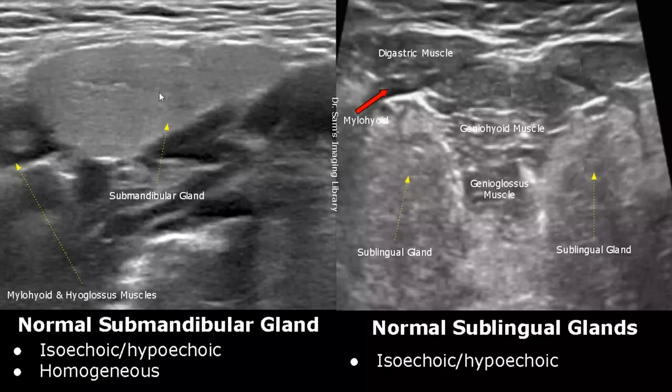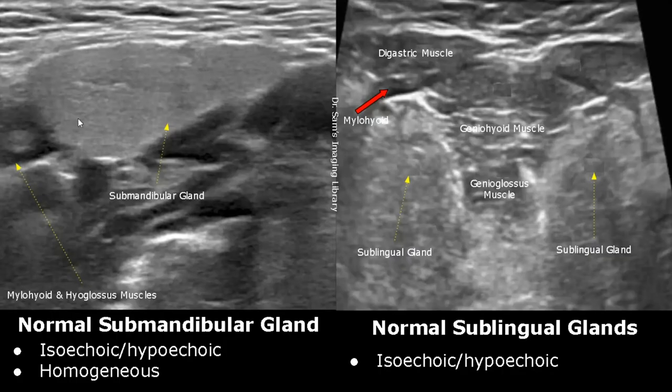This is the normal submandibular gland. It can be isoechoic or hypoechoic to adjacent structures, and it also has a homogeneous echo texture. Here, these hypoechoic structures are the mylohyoid and hyoglossus muscles.